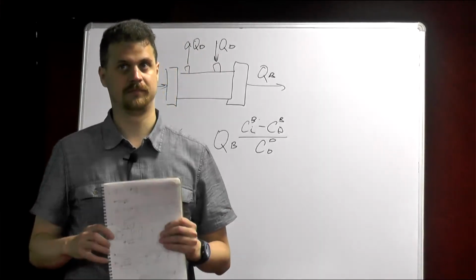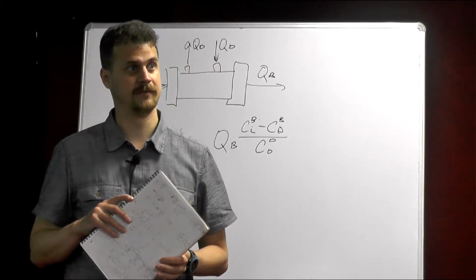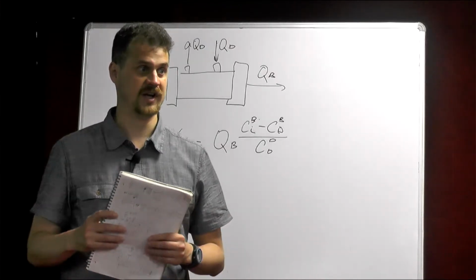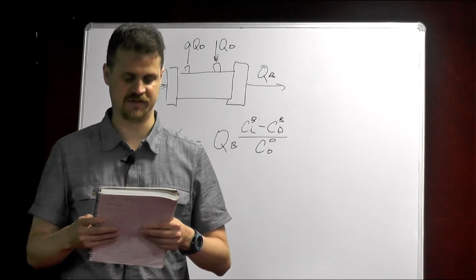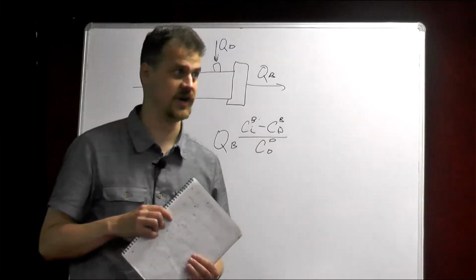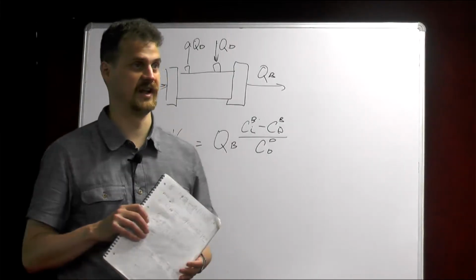Development of the urea sensor is a very complicated topic. There are industrial urea sensors, but there is still a big challenge to create the same sensor for medical application, specifically in dialysis.